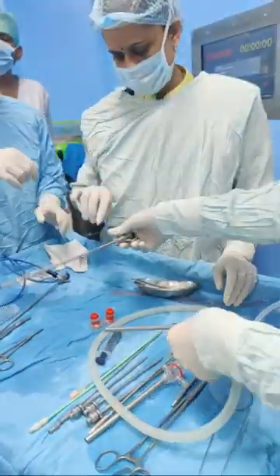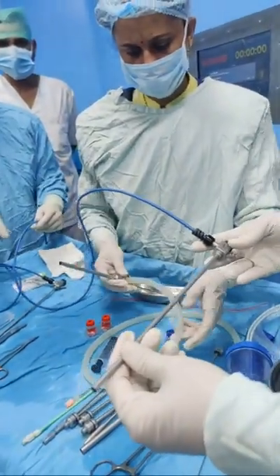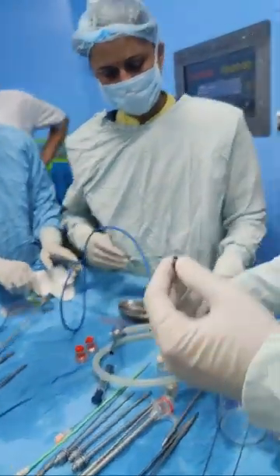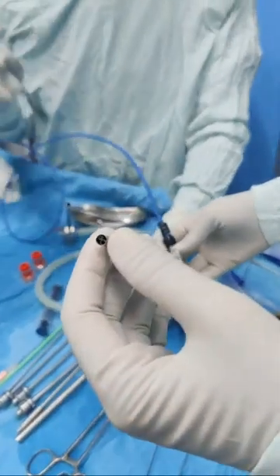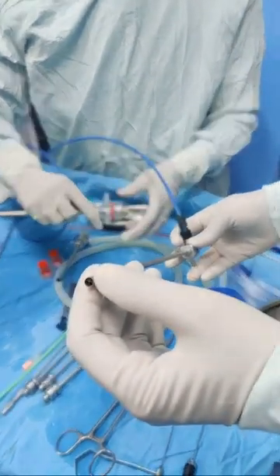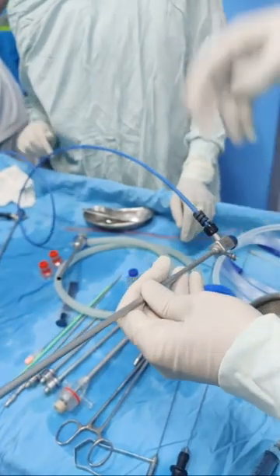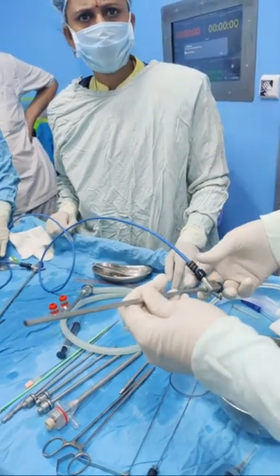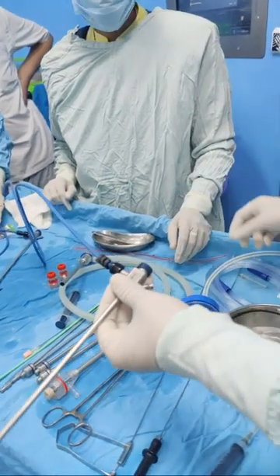Now the other instrument is the super nephroscope. This is a nephroscope with a long length of 26 centimeters. It has a separate instrument channel and a separate irrigation channel, and the light source is at the tip. The image-carrying camera is at the tip of the nephroscope, as compared to the conventional nephroscope where the light source is outside. The camera head is outside there; here, everything is inside the nephroscope, and you can use any size.